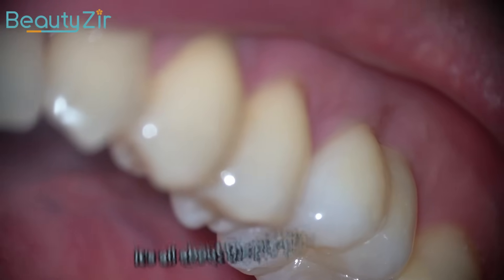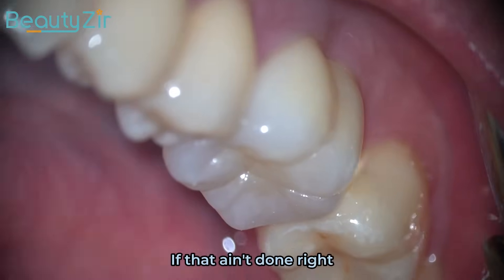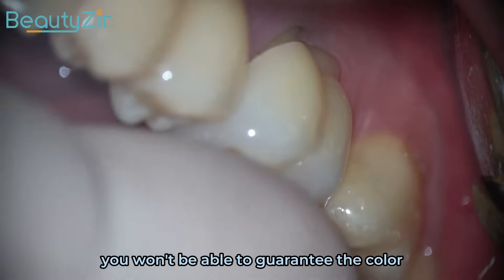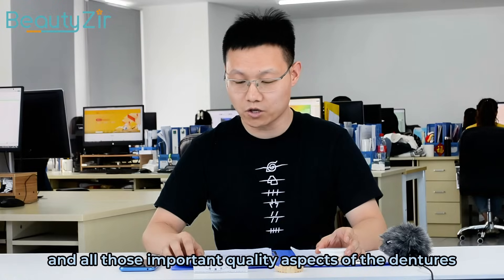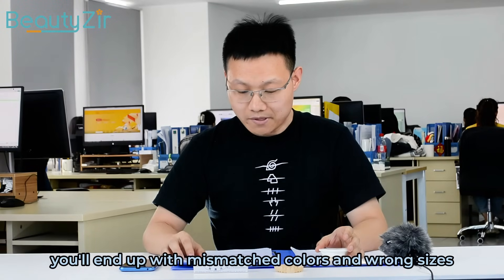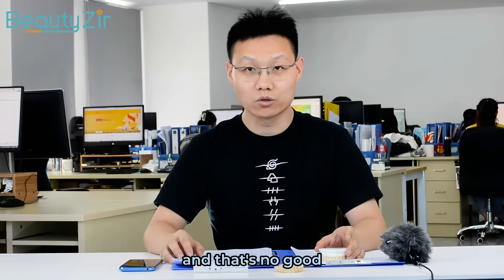Then it's all about the pre-processing. If that isn't done right, you won't be able to guarantee the color, brightness, transparency, and all those important quality aspects of the dentures. You end up with mismatched colors and wrong sizes, and that's no good.